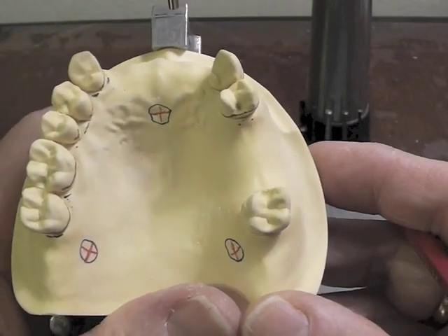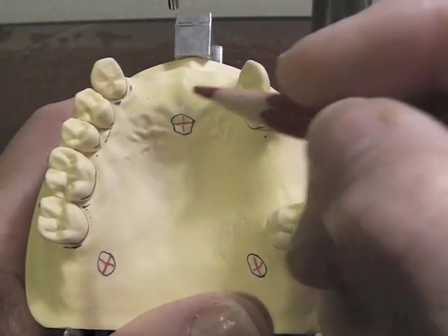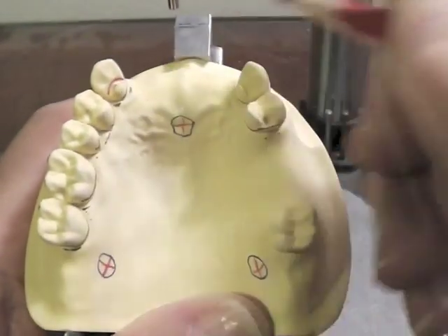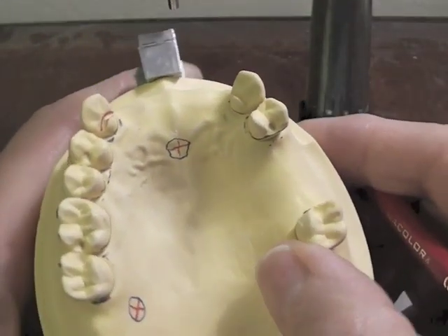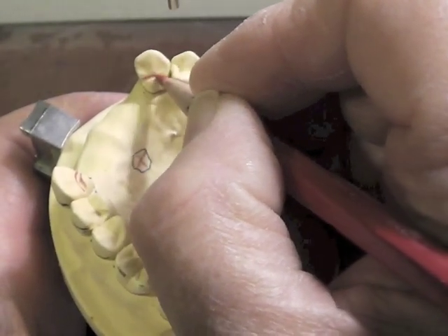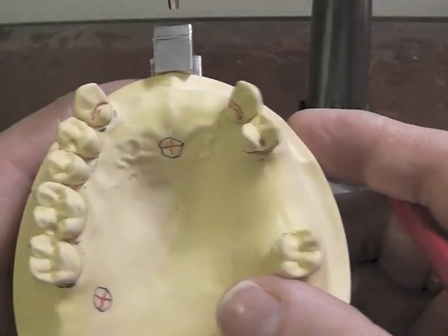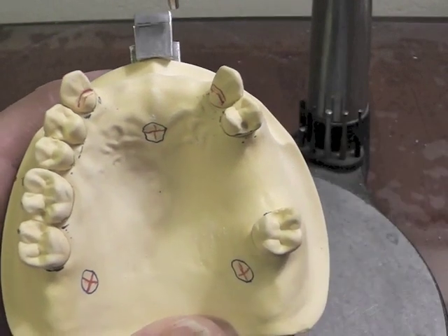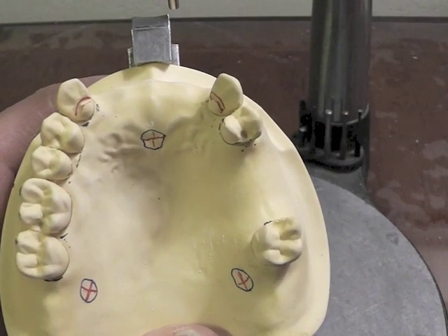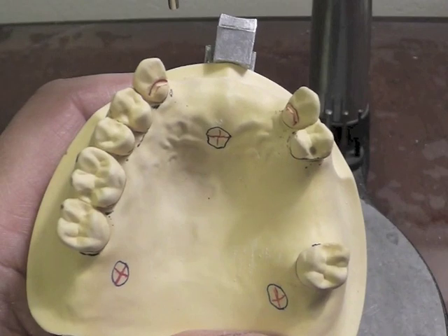We're going to transfer that design now onto our cast. I like to begin by placing my rest first. The Kennedy Class III requires a rest next to each edentulous area. In this anterior edentulous area, I would have a rest on each of these canines, and it's going to be a cingulum rest because the cingulum rest is more aesthetic on a maxillary canine, and the enamel is very nice and thick back there, so we can afford to have a natural cingulum that can be reduced to have a rest.